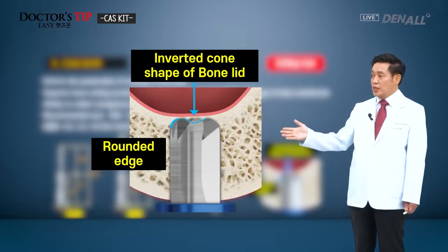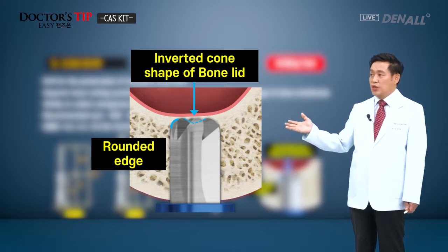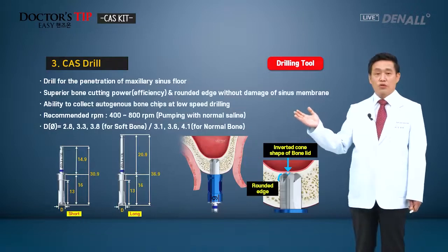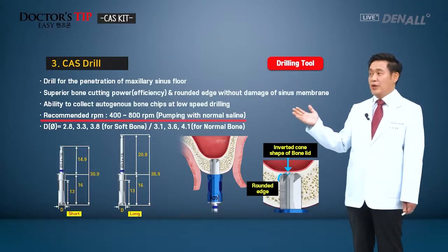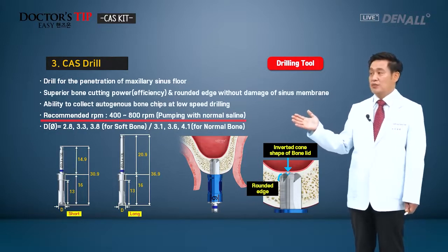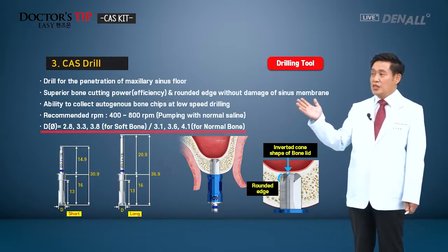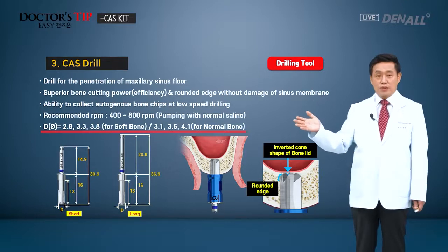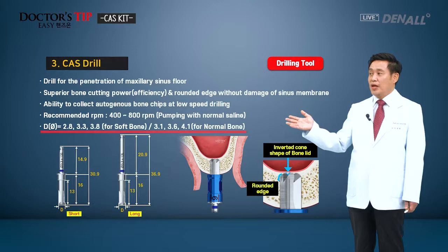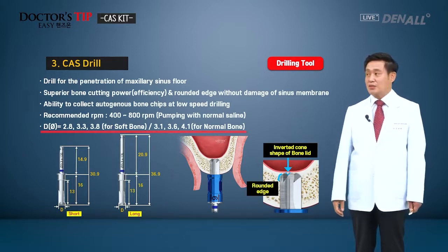Next, if it is drilled at a low speed, the side of the straight drill is designed to collect the autogenous bone chips. The recommended RPM is around 800. Then you'll be able to drill easily without problems. There are a short one and a long one. The diameters of the drill are 2.8, 3.3, 3.8 for soft bone, and 3.1, 3.6, and 4.1 for normal bone.